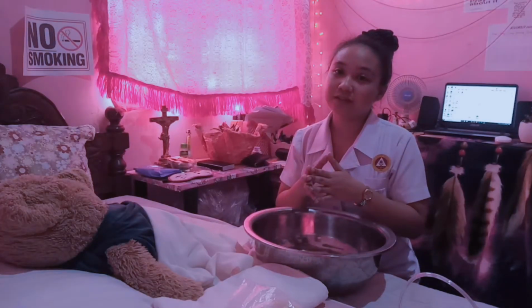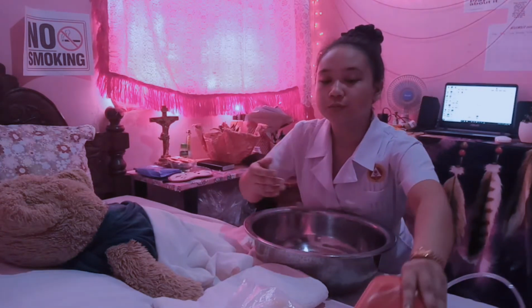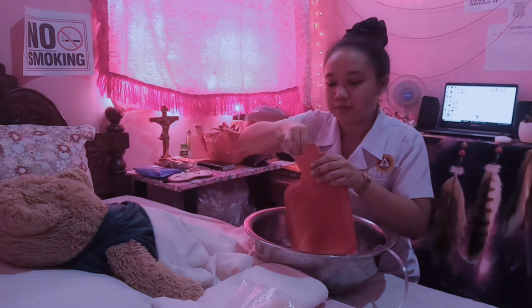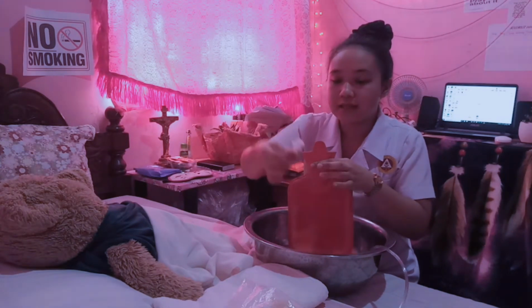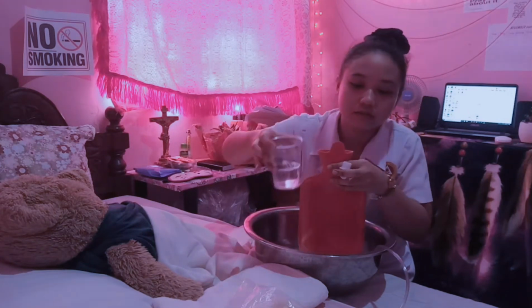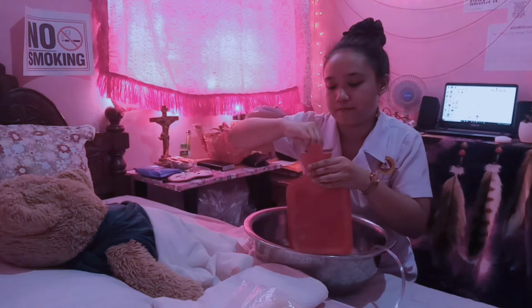And before we proceed to the implementation, the first thing we need to do is to put the right solution, amount, and temperature of enema into the drainage bag. So let's say for instance, and then make sure that you close it.